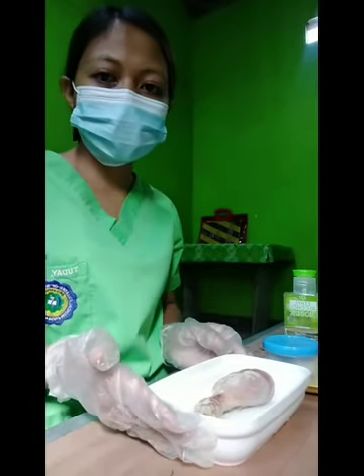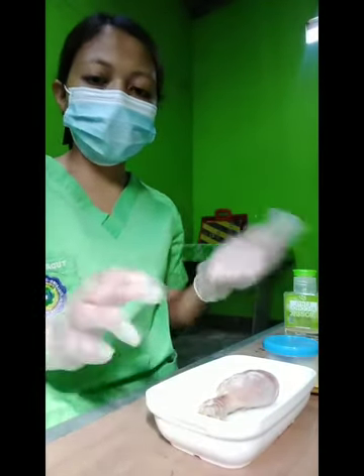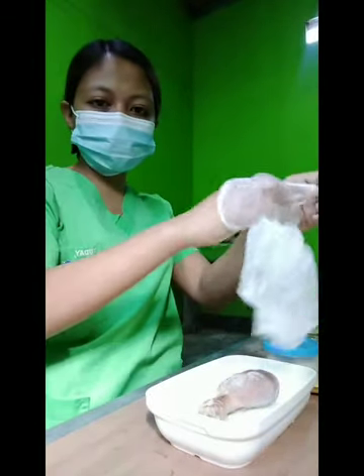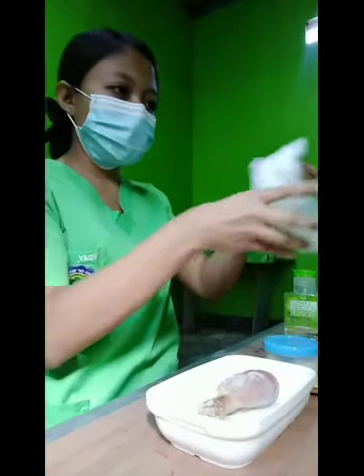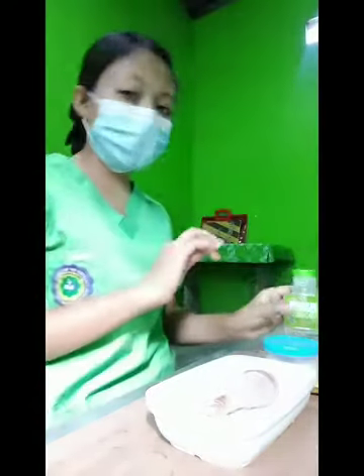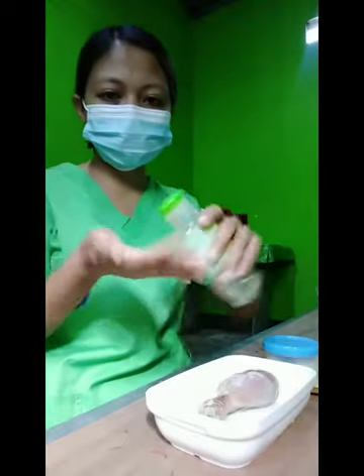Assist the patient to a position of comfort. Then remove the gloves and dispose of them properly. Then perform hand hygiene.